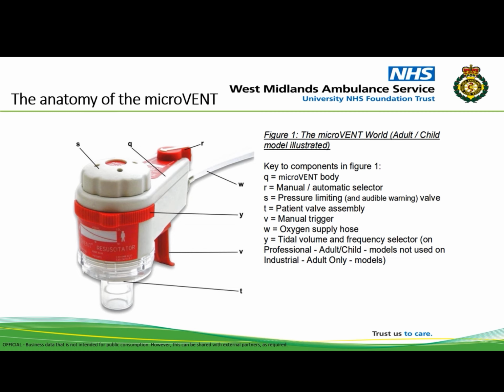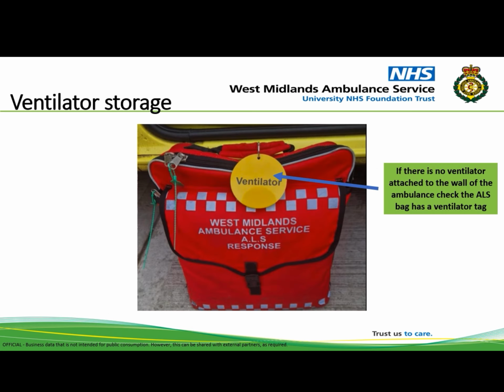Remember, at all times you must ensure that there is adequate ventilation for the patient, assessing rise and fall of the chest, oxygen saturations, and end-tidal CO2. The ventilator can be found within the ALS bag. Bags carrying the ventilator will have one of these tags attached to it to indicate a ventilator is within the bag.